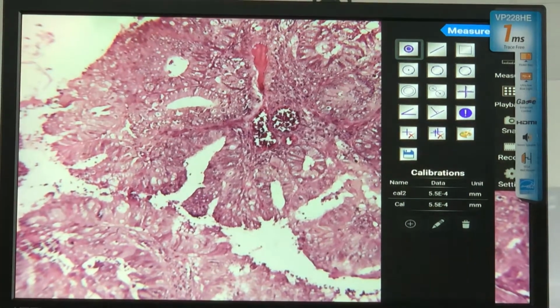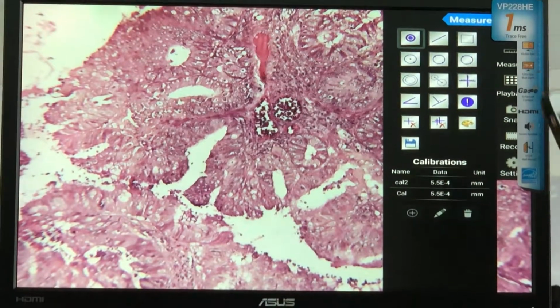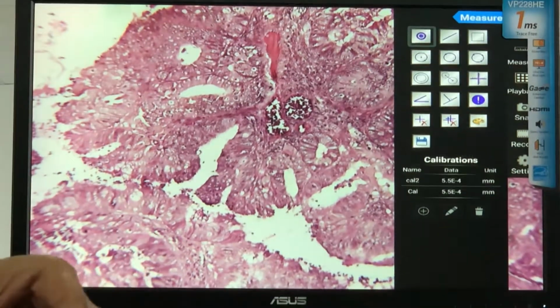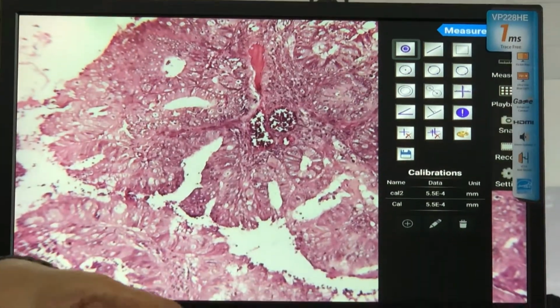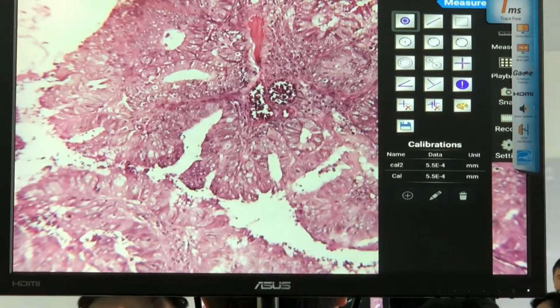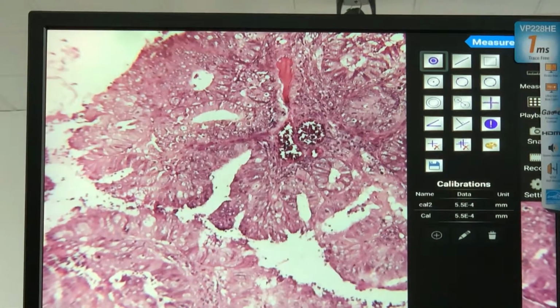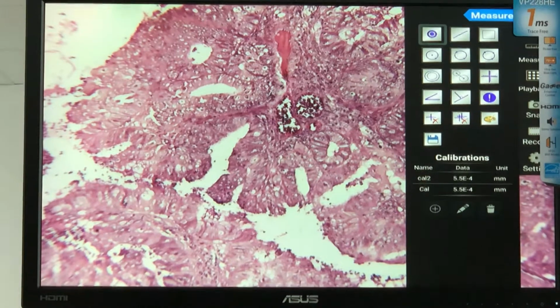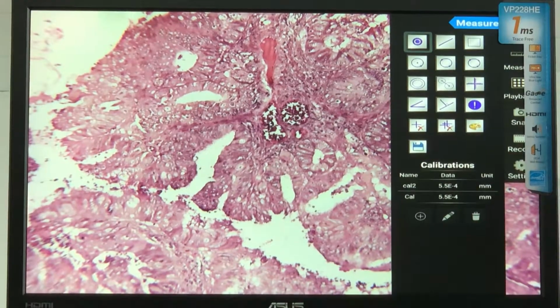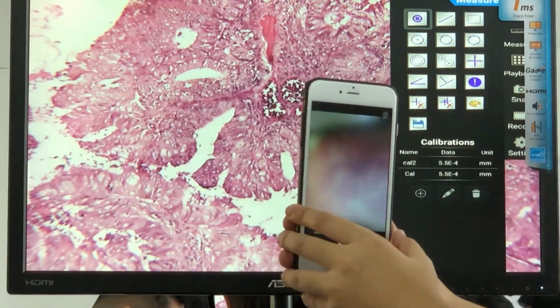Okay, so this one, slide 245, endometrial hyperplasia. Parang flower. So we go to endometrial hyperplasia. This is also a commonly biopsied specimen, from scraping. If you want to rotate in gynecology and you want to master and specialize in gynecology, you will have a practical exam on this one, endometrial hyperplasia.